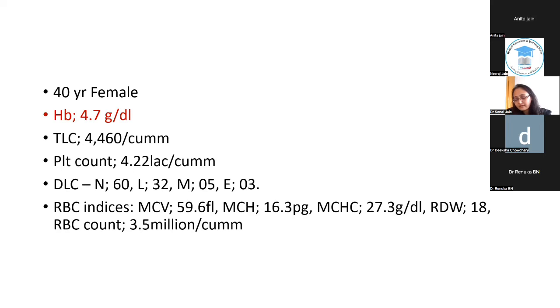Sadly, in whatever experience I've had, smear examination and smear making per se is losing its importance in the name of automation, saying that counters can give everything. But we have to understand that counters give an average, or any statistic, mean or median or whatever. They don't give a glimpse of what is going on in the red cells. The smears do tell us a lot.